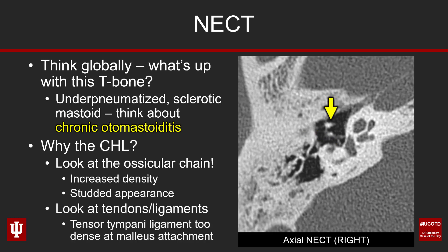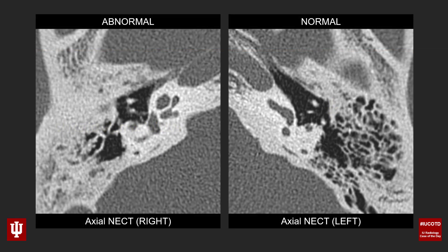Looking at the tendons, we can see where the tensor tympani tendon attaches to the neck of the malleus — that's also too thick and too dense. Don't just take my word for it though; in this case we have a comparison on the contralateral side as an internal control. As we look at our abnormal right side and our normal left side, these findings are in and of themselves a bit subtle, but together they point to a uniform diagnosis.